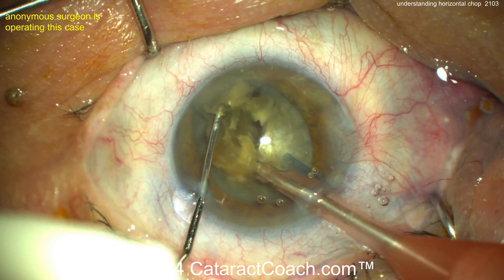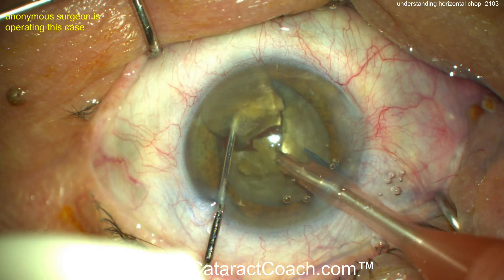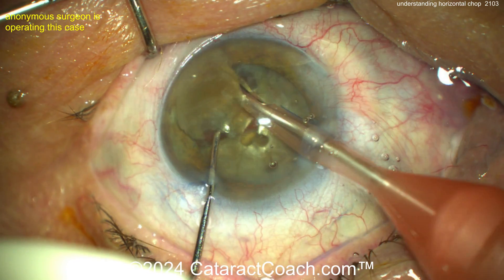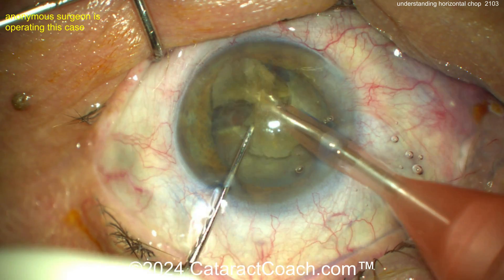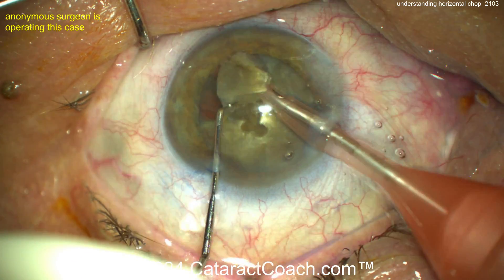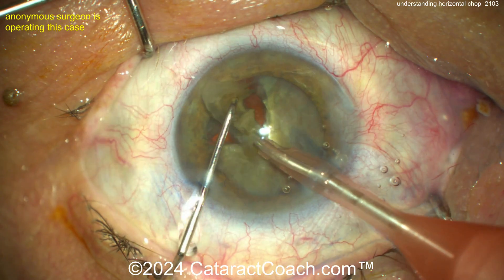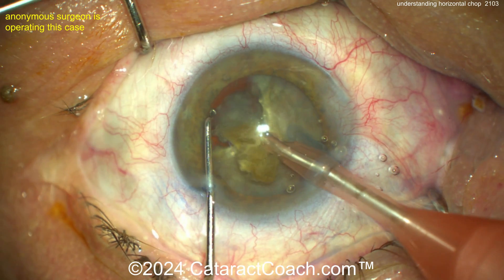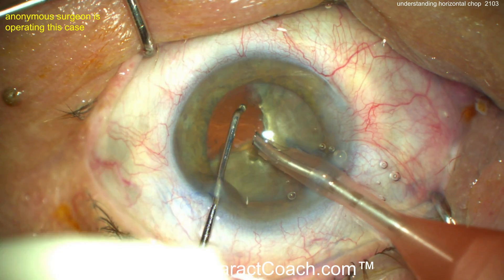That first quadrant can be brought up out of the capsular bag and then just chopped at the iris plane — that looks like a very nice technique too. Just stay away from the endothelium. Chopping it into smaller pieces works well given the pretty good density in this nucleus — not a soft lens at all. Once you get that first quadrant out, it gives you a lot more working room. You can then resume chopping; not much cortex remaining.